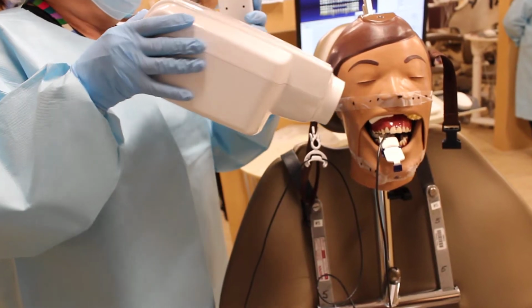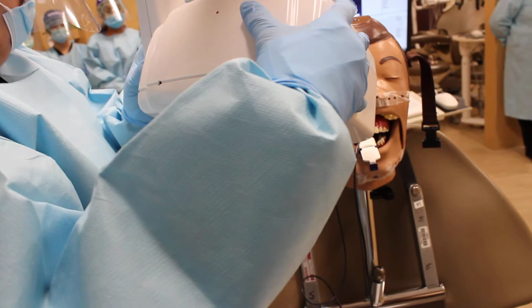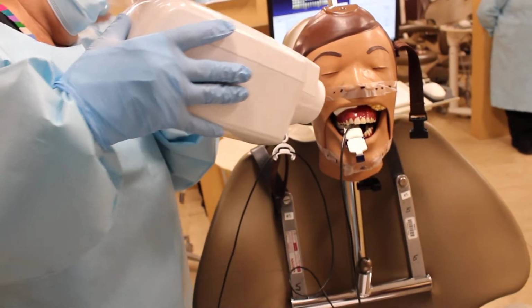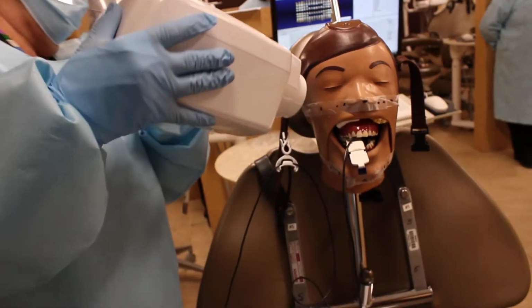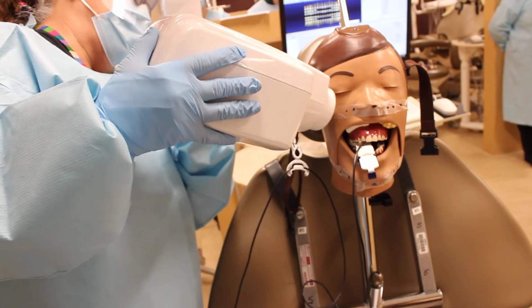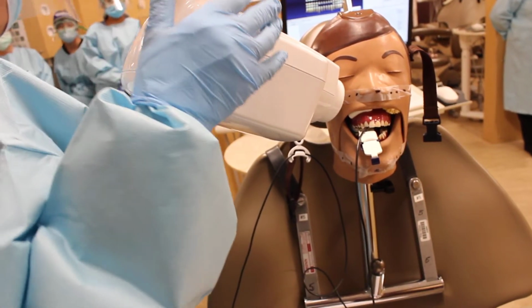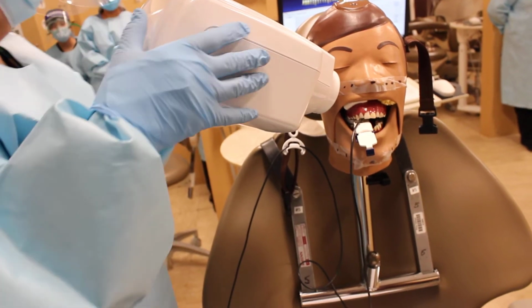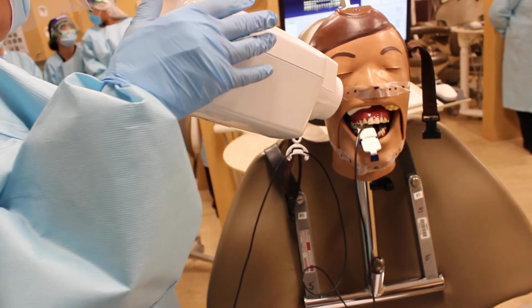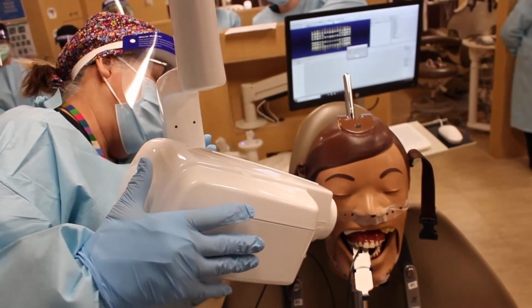Angle. I am not going to come in here, even though I can hit the dot there. You want to follow the curvature of the face. So I'm going to put it right at that dot, the central ray, the very middle of the PID at the dot, without changing my angulation. That's why it's crucial that your patient's sitting straight up. That's the only way those angulations will work. If you lay your patient back, it's not going to work.